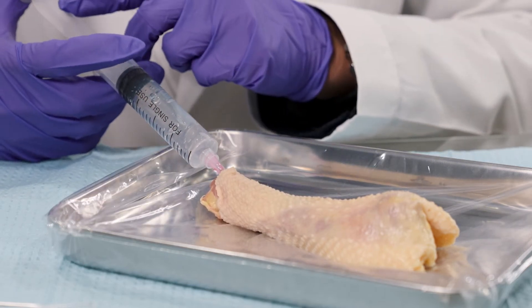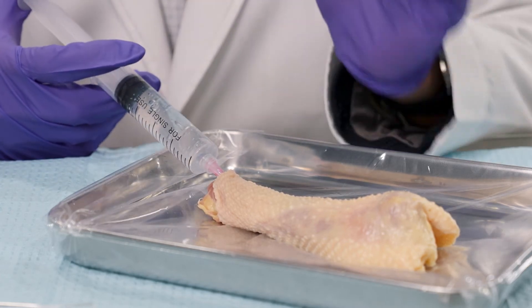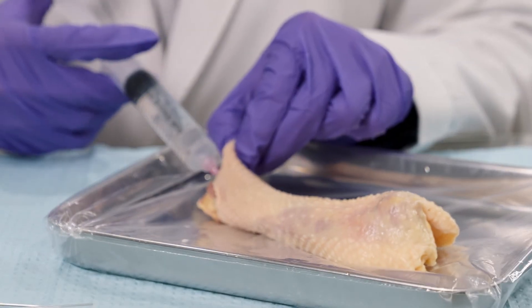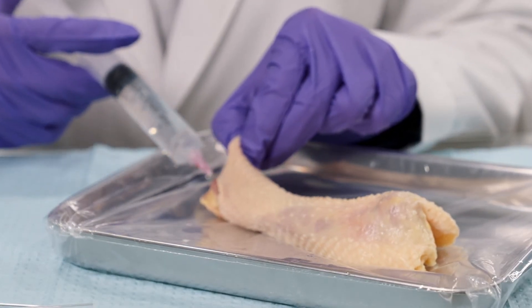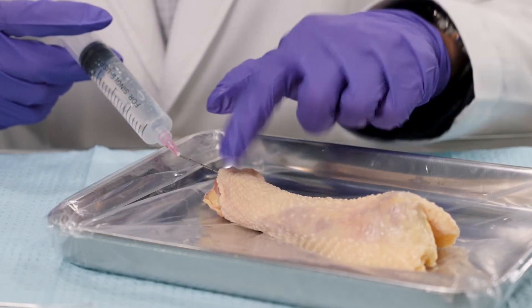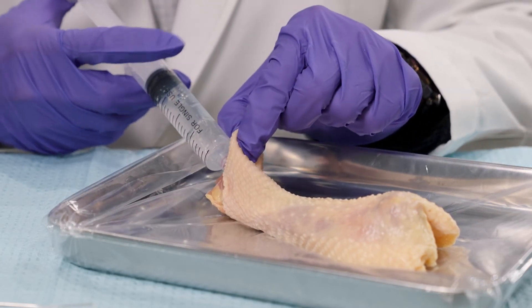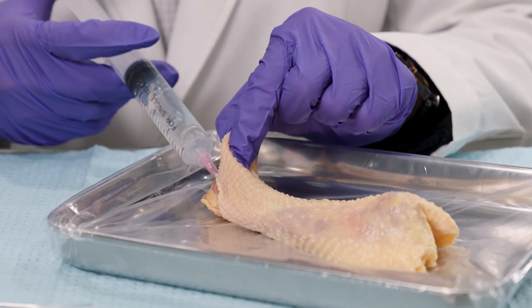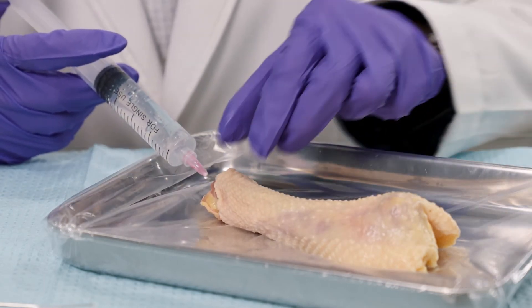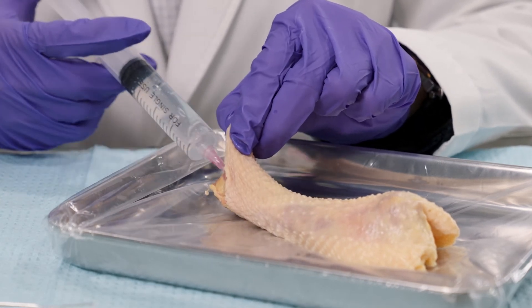Control over the syringe and plunger pressure is of utmost importance — your practitioner should be very skilled in modulating that pressure to deliver the precise amount of product. The motion continues back and forth, using more than one entry point. We're strictly underneath the skin — you can't inject filler into the body of the organ because you would occlude the blood vessels and block circulation, so the subcutaneous plane is where we work.